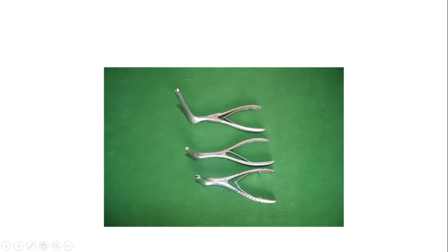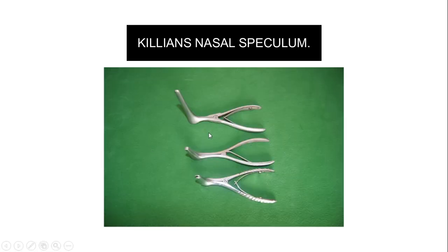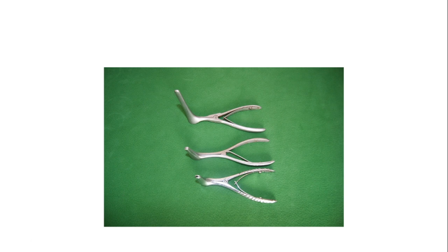This is the Killian's nasal speculum. The Killian's nasal speculum is mainly used in operation theatres for surgical interventions. When we place it in the nasal cavity and press the handles, it opens and dilates the nasal cavity widely to expose the structures inside during various nasal surgeries.